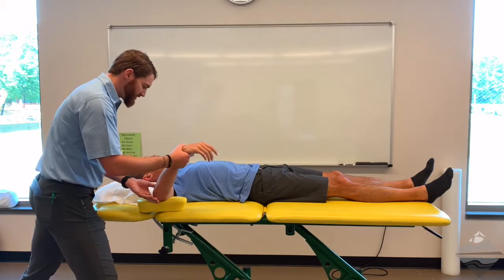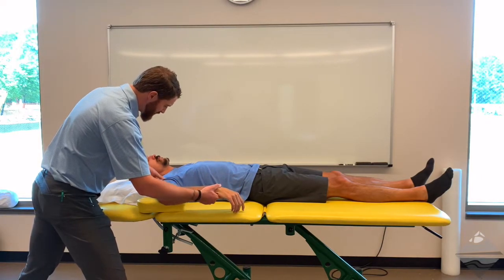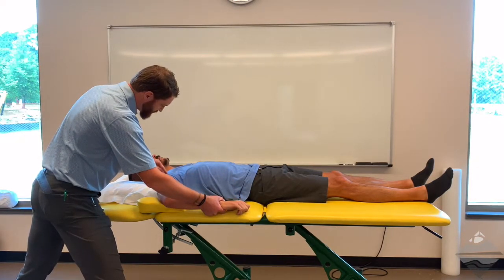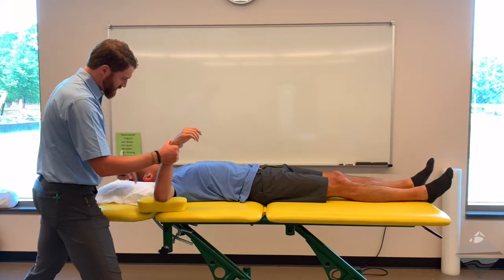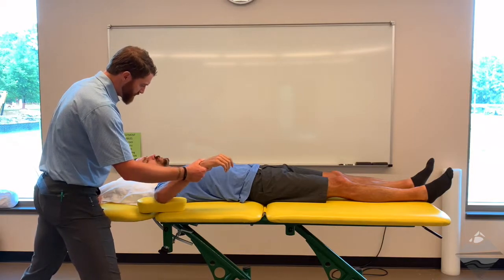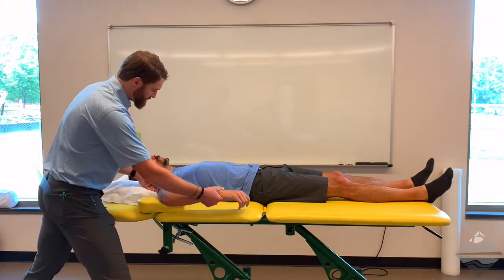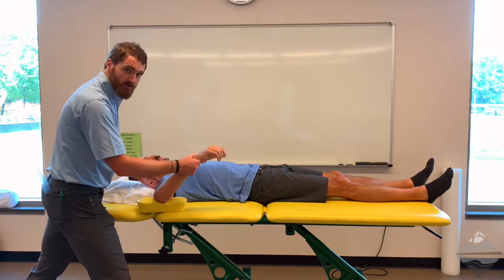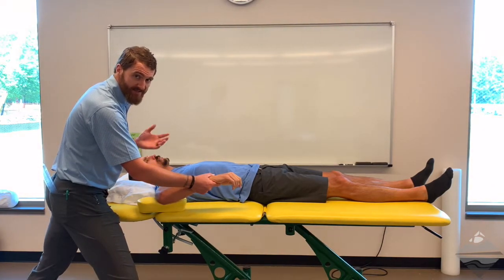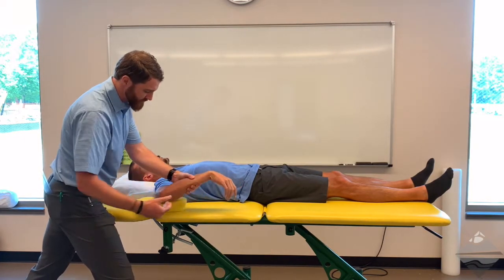When we move into internal rotation, one of the things we're palpating for is the acromion. When the acromion starts to lift and come along for the ride — yes, we can get more internal rotation — but look what's happening at the shoulder. We need to palpate the acromion, and as soon as we start to feel it move, it's no longer the joint that's moving but now the scapula that's tipping anteriorly. So that's where we would stop the range of motion and take our measurement.